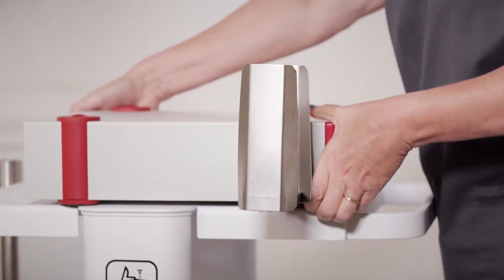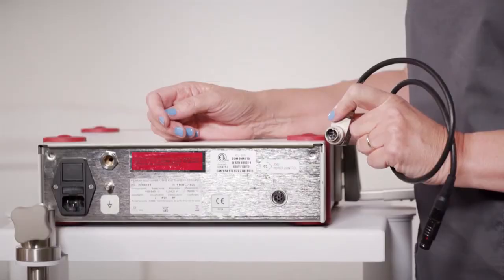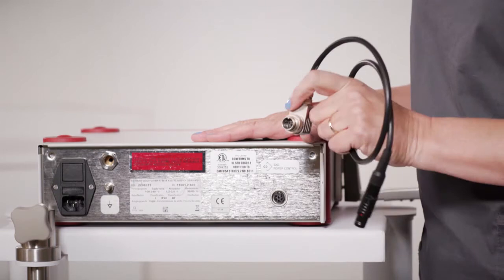Now move the suction pump unit so that the holding bracket is on a flat surface as well. To assemble the back of the unit, we will first attach the connection cable.